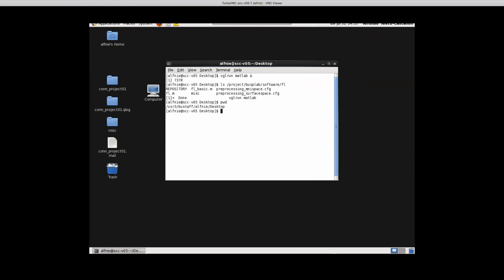When we do preprocessing in volume space, we also resample to whatever space we want to have every subject in. That's going to be our MNI space, and we typically choose 2 millimeter isotropic voxels, no matter how you got your functional data. The surface level analysis pipeline works in the same way. You typically want to resample your data up to whatever resolution and space you want to keep your data on, and from that point every subject is co-registerable with each other, and that makes life simpler.